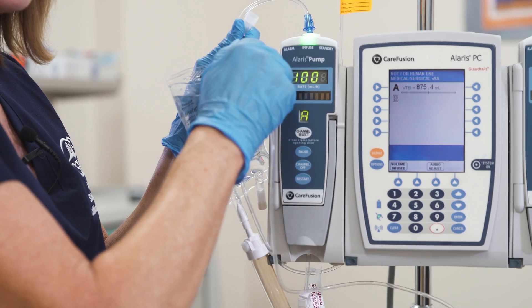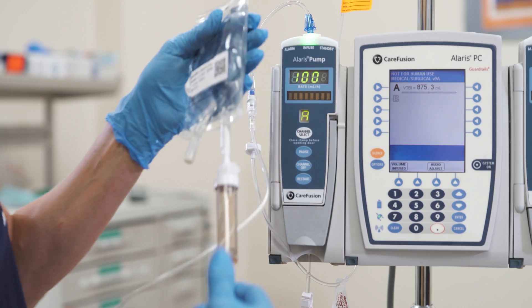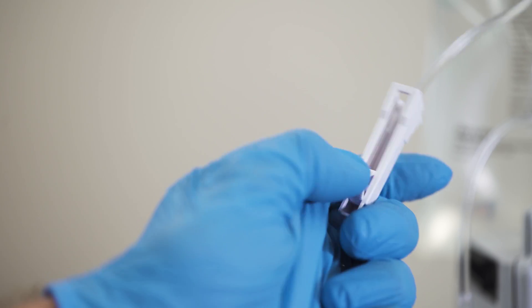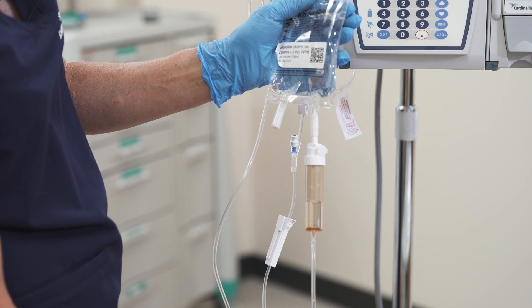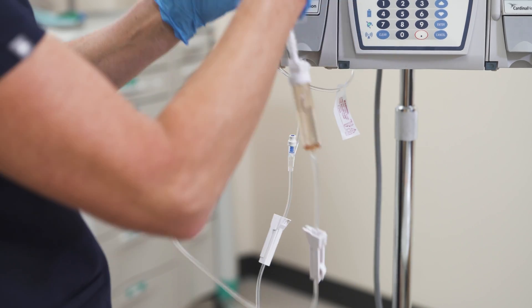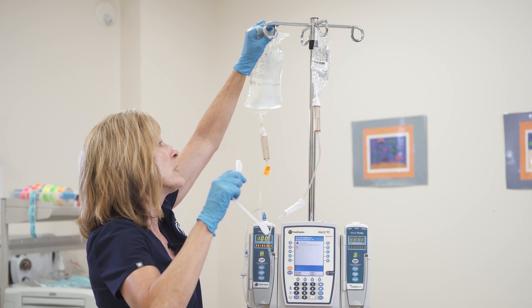I'll twist until it's secure. At this point I'm going to fill my secondary tubing — after pausing the pump — by slowly opening the clamp and allowing the fluid to flow up into the chamber until it's halfway full. Then I will drop down the primary solution.